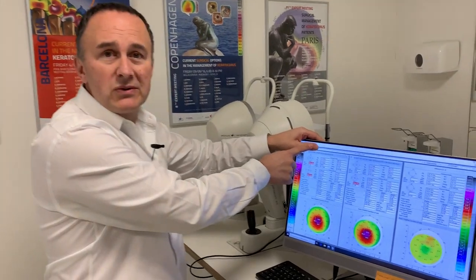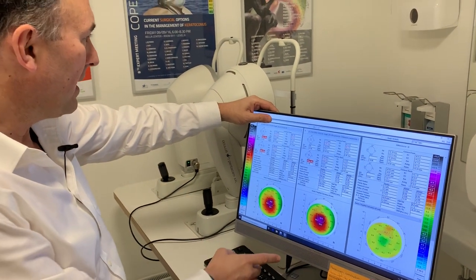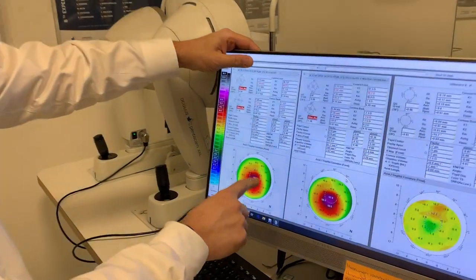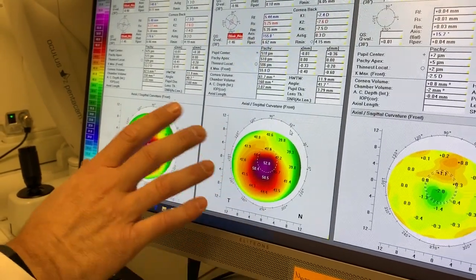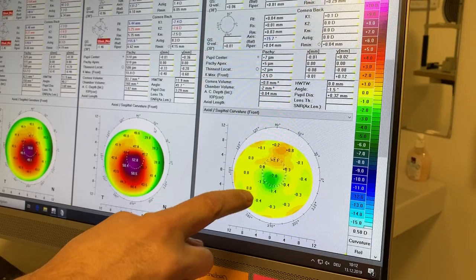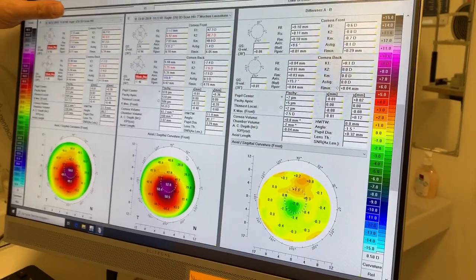I'm having my thumb here to keep patient confidentiality. This is a patient I have crosslinked almost one year ago. This is the state of the cornea with the keratoconus — this was a few days ago, and this was before crosslinking. When we put both images together, we see in green that the cornea did not only stabilize, it improved. The green means improvement over the cone.